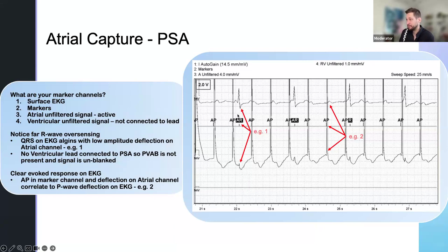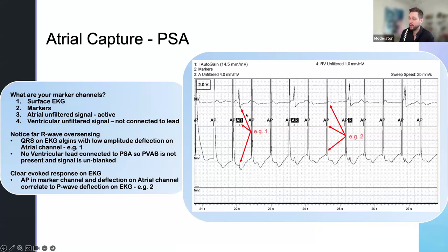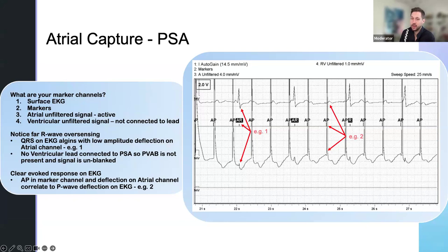Looking at this one, you have this QRS complex unblanked. Moving to example two, you see P wave evoked responses after every single pace. What can I take away from this? It means that we are capturing at two volts. We have a little bit of sensing, but that's okay because we're only in an AAI mode — the device just doesn't know to blank. We have a good signal and good indication of P wave. Unfortunately this patient does not have good conduction, so you really can't use conducting down as an indicator.